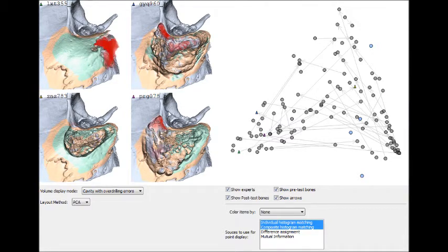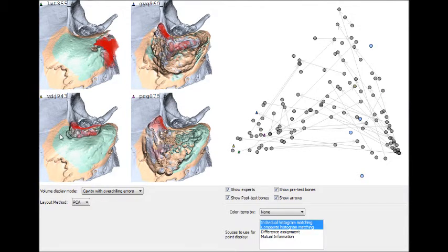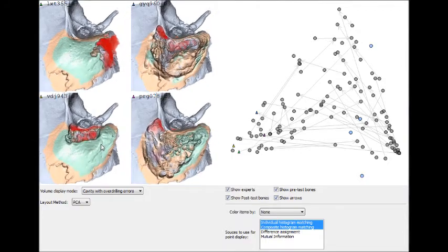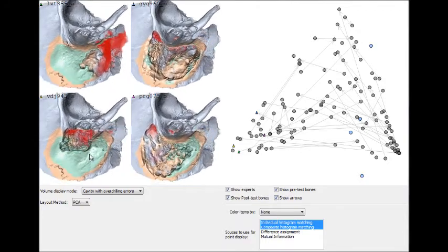The red color in the volume display shows areas that were drilled away by the user but were not drilled away by any of the expert examples.